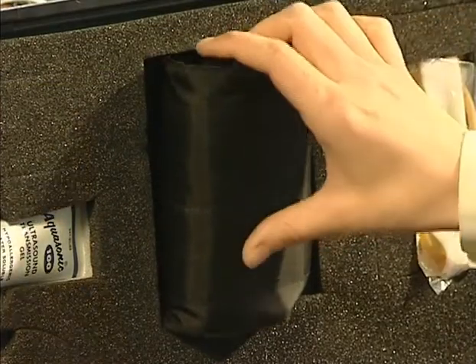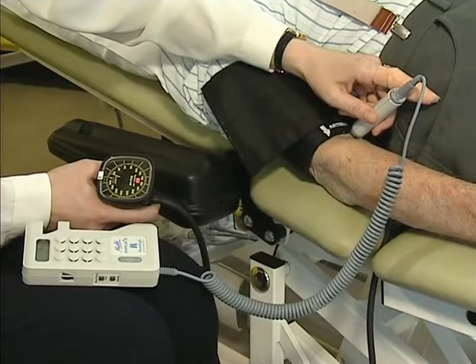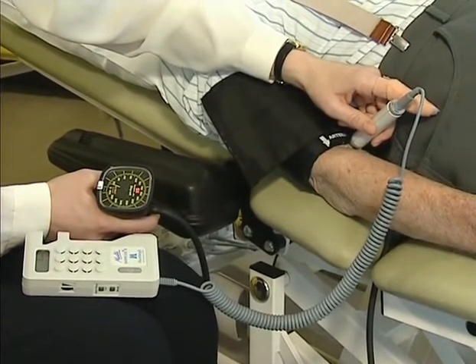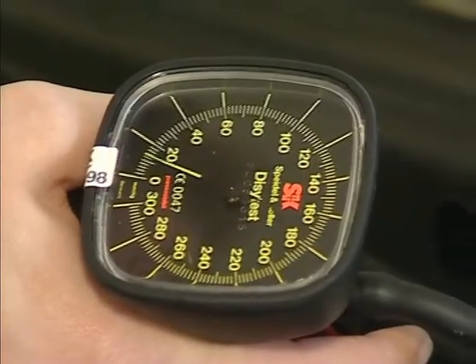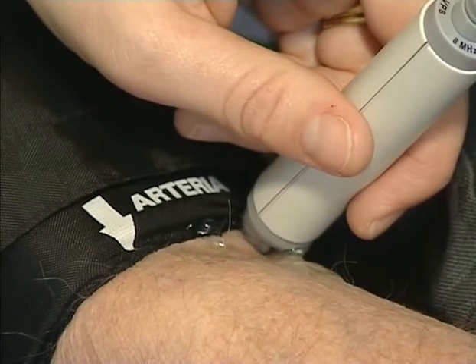Another test that we can perform is the ankle brachial pressure index. Using the Doppler, take the brachial systolic pressure in both arms. Use the higher of the 2 readings in your calculations. If the readings are significantly different, this suggests arterial disease.